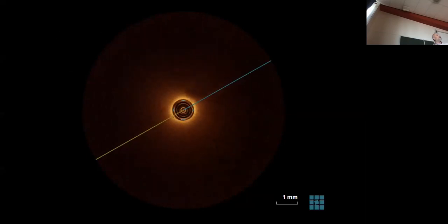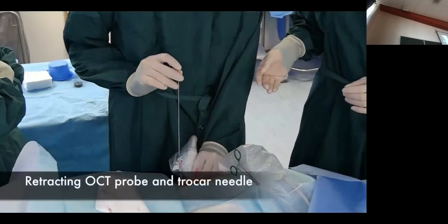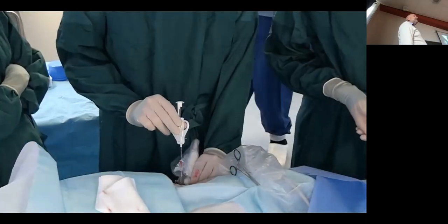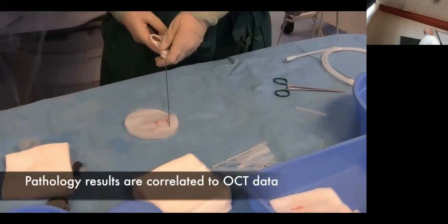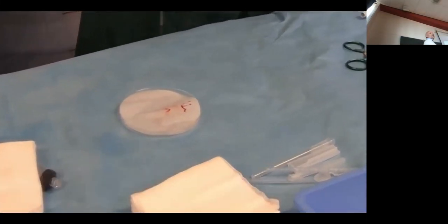So my question is, do you have any idea where the diagnostic information is? Is that in this beautiful structure or in the noisy part of the data set? Any idea? We also take, by the way, a regular biopsy from exactly the same location. That's the biopsy here. It gives you these types of tissue slides that are brought to the pathologist for further analysis.